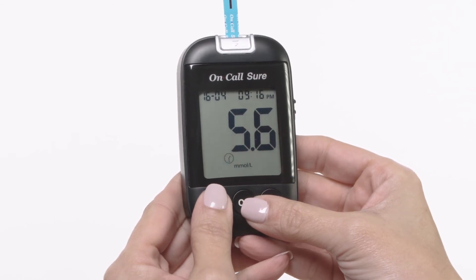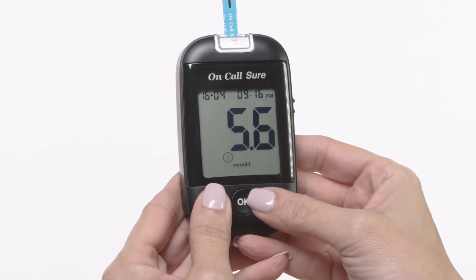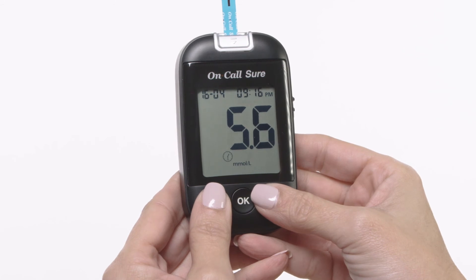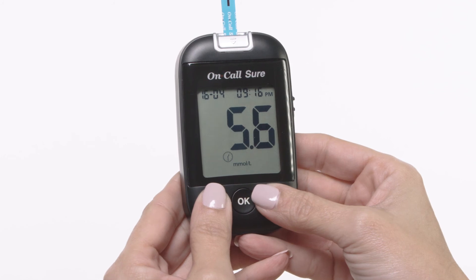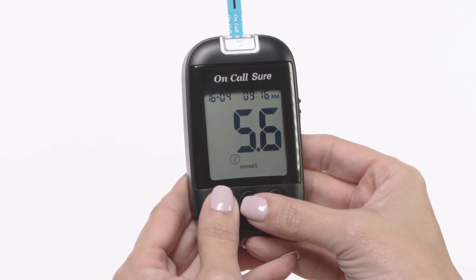Press the down and up buttons together to display the before meal marker symbol, indicating the result was taken before a meal. Press the down and up button again to display the after meal marker symbol, indicating the result was taken after a meal. After deciding the selection, press the OK button to confirm the selection.